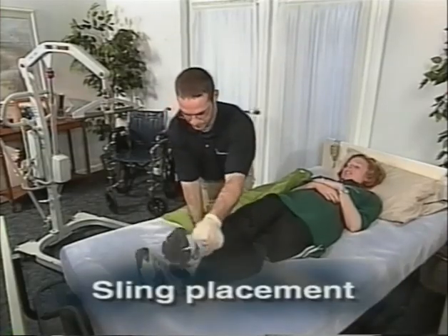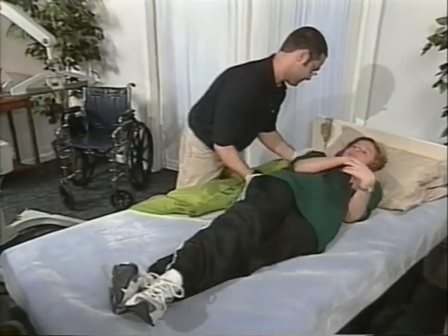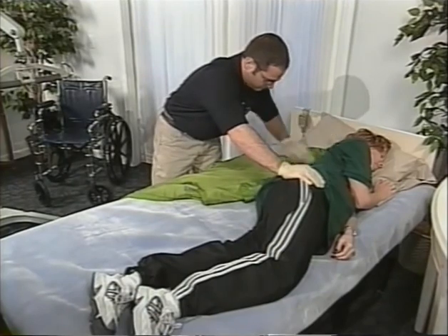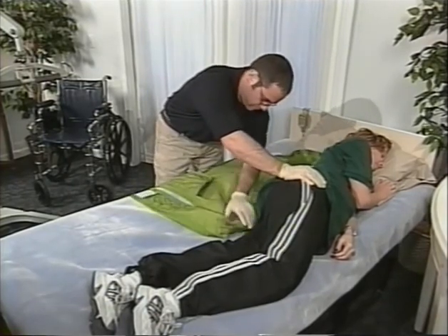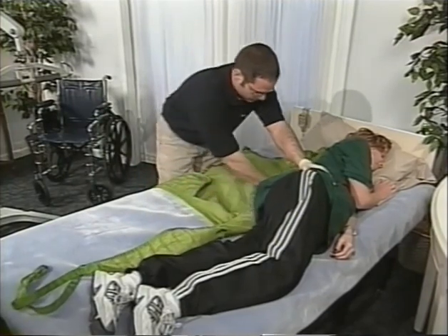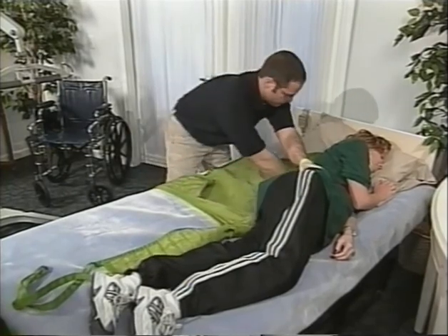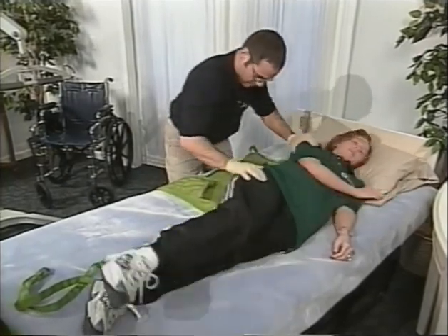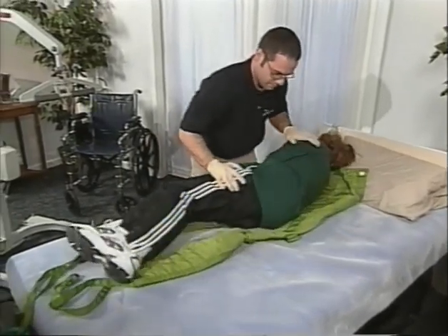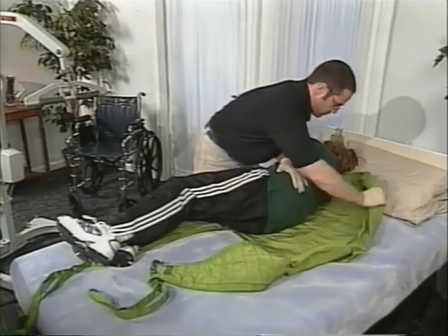Place the sling under the client. Roll the client to one side and place the rolled sling under the client. Make sure the loops are facing the outside. Then, roll the client to the other side and unroll the sling. Make sure the center loop lines up with the spine.